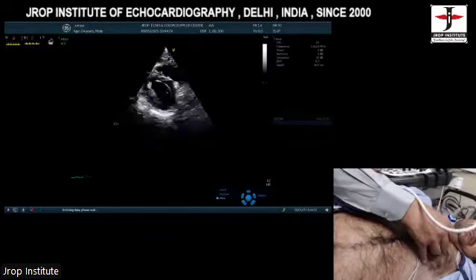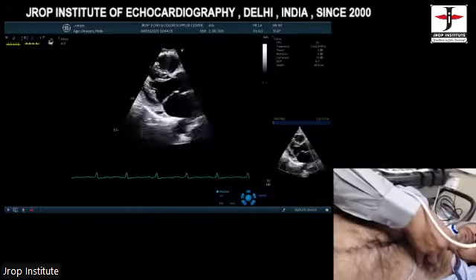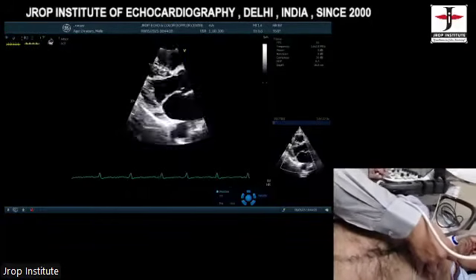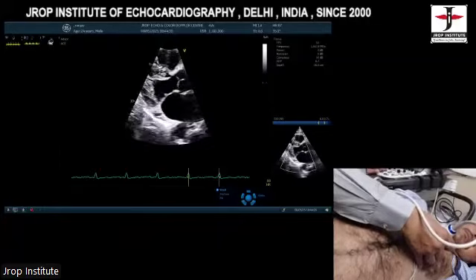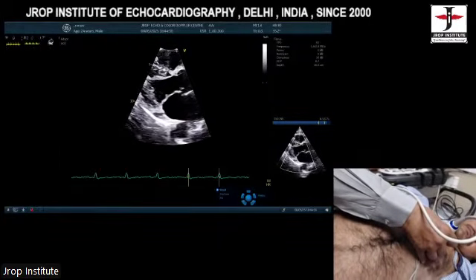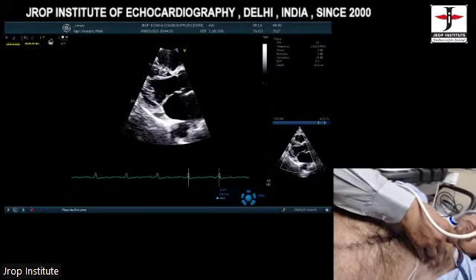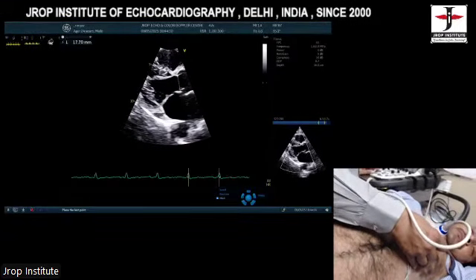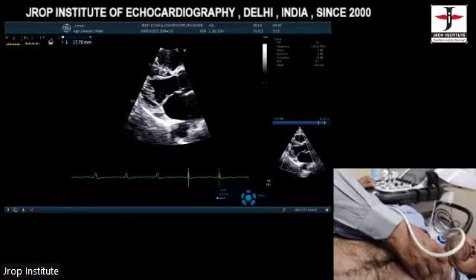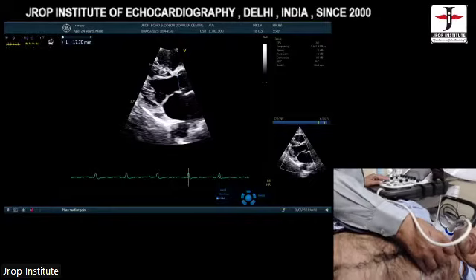Then, in the same way, we measure my LVOT. Many books will say many things, but where we have to measure the LVOT is at the hinge point of the aortic valve leaflets. So if this is the hinge point of the aortic valve leaflets, this one over here, this is the hinge point of the aortic valve leaflets. So these are the aortic valve cusps, right coronary cusp, non-coronary cusp.